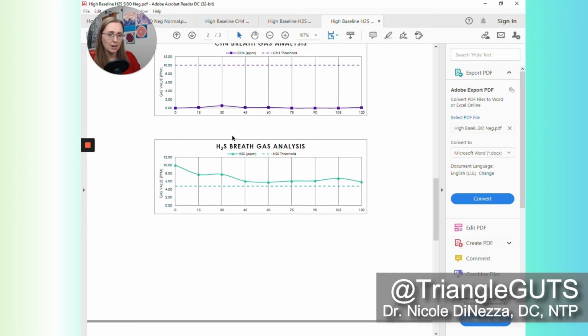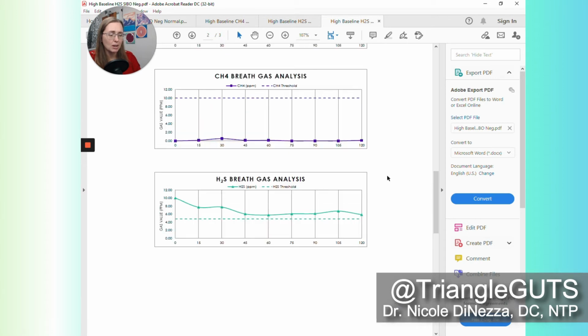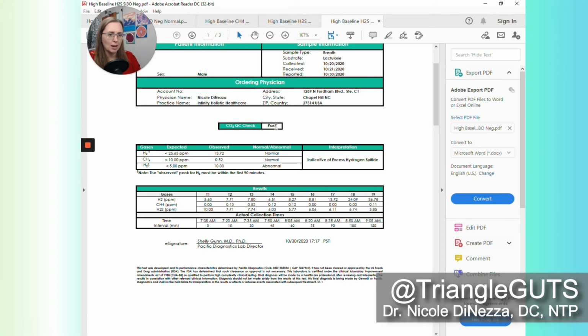And then here we have yet another elevated baseline for hydrogen sulfide, and then it goes down, it goes down, it goes down, and it kind of peters out a little bit, but it is still higher than 5 parts per million throughout the entire test. Now again, let's look up here to the top. It says it's indicative of excess hydrogen sulfide. It says the observed peak for hydrogen must be within 90 minutes. Again, with lactulose, I would argue 60.